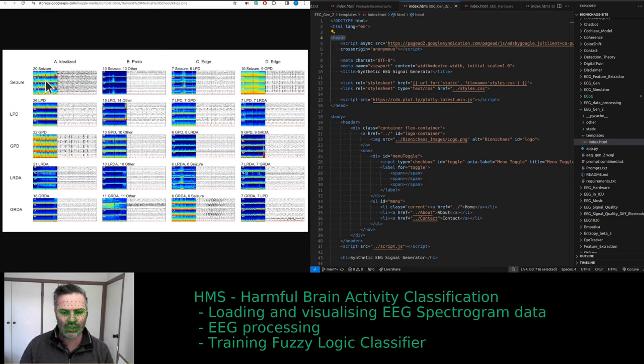So essentially, I think that one should just look at the spectrogram. You essentially have one, two, three, four spectrograms in this one image there. I don't know if that's the seizure there. You should be able to see the... Those images are meant to be clearer. In this case, all the reviewers agreed and labeled this segment as seizure.